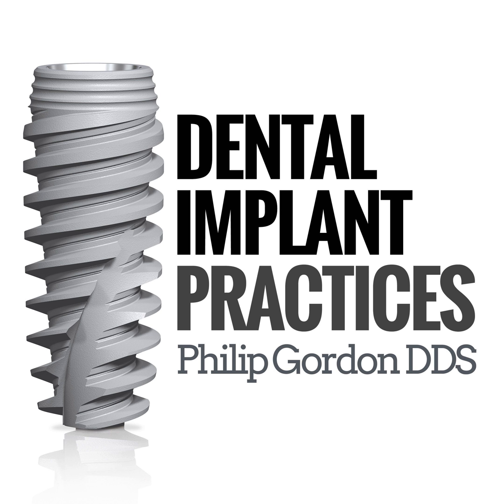So as some new devices came along, we took the courses back in around '78, '79, aluminum oxide ceramic implants came to market. The problem with those, they were one-piece ceramic implants. They were biocompatible, but they weren't biofunctional. We didn't know that. And most of them fractured. They integrated, and cutting those implants out was really tough because it was almost as hard as zirconium. So cutting them to remove them was a difficult situation.